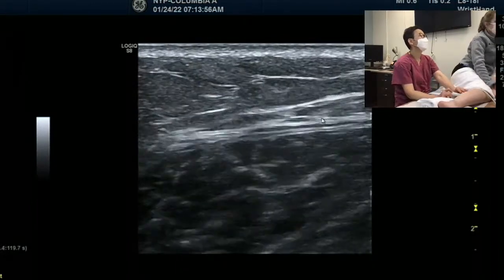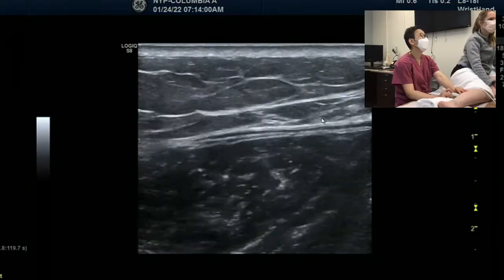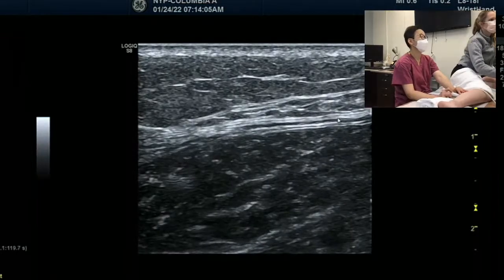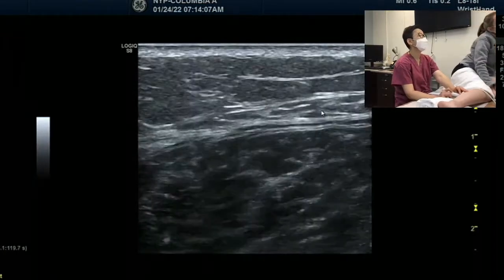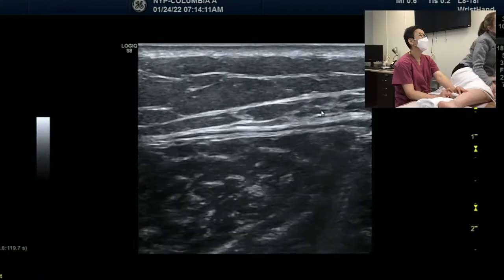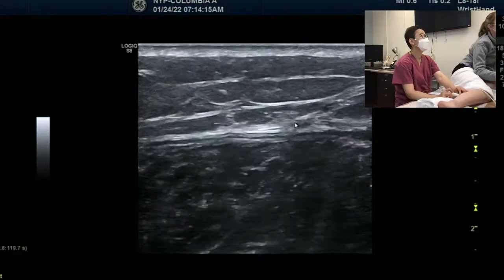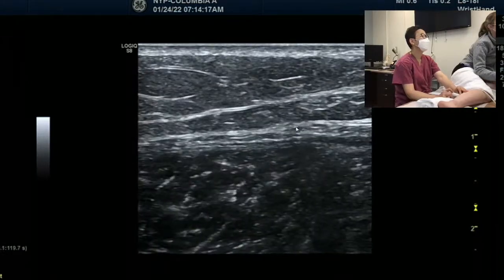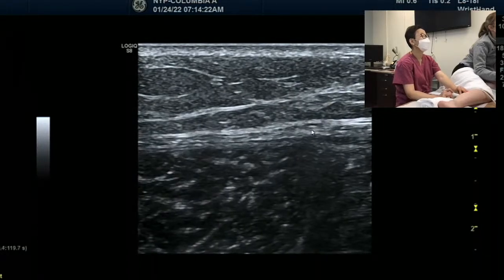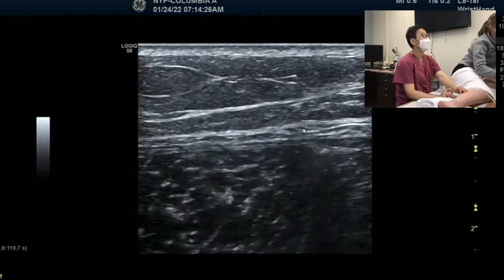So look, now I'm going to go up. I'm going to go down. When I go down, it's very clear, right? Sural nerve. And then if I move my probe proximally, see now it becomes flatter. And splitting too. See? Two. One, two. One, two. Oh my god, you and I have consensus. One and two, right?